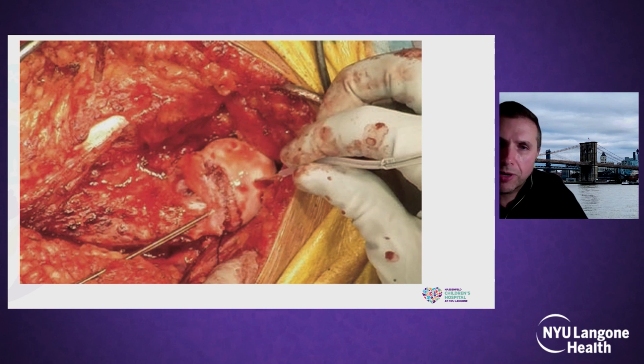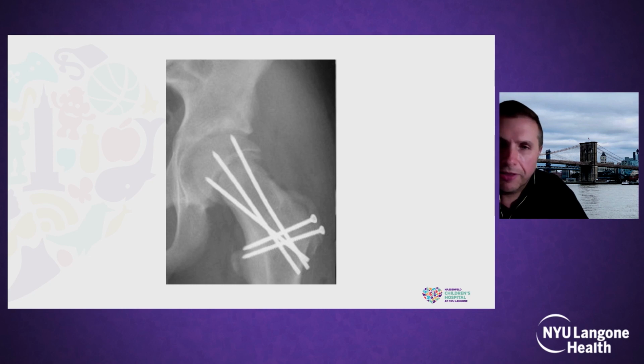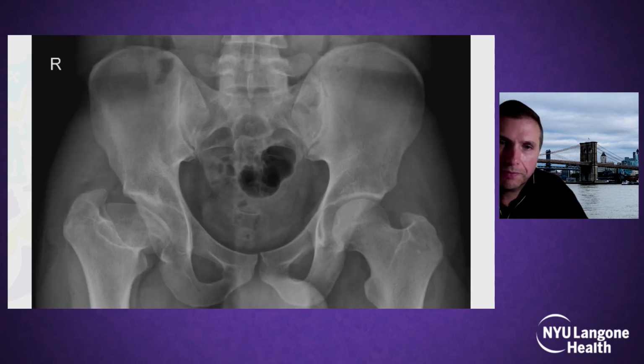And then you can actually replace the femoral head back onto the metaphysis, then get some fixation, and you get some anatomic alignment. Now, this is a procedure which has high inherent risk. And although you can hit a home run, like in this case, where we got anatomic alignment, and at long-term follow-up, you see that head survived with near anatomic alignment. But this is a high-risk, high-reward surgery, and it's not without its complications. But this is clearly not going to be addressed by arthroscopic surgery.